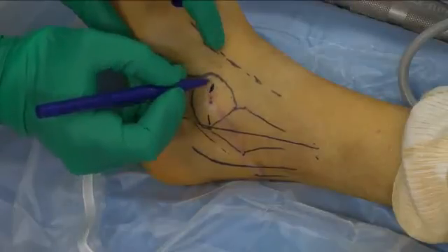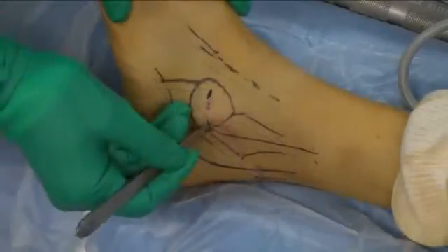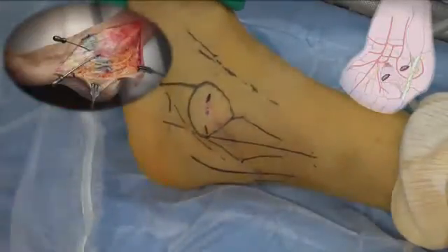The middle portal is just anterior to the tip of the fibula, and the anterior portal is just opposite on this same equator line. The correspondence may be seen here with a cadaver specimen and an artist's view.